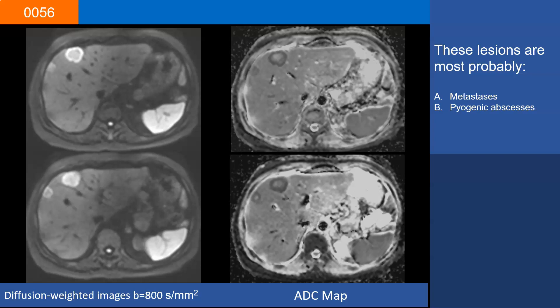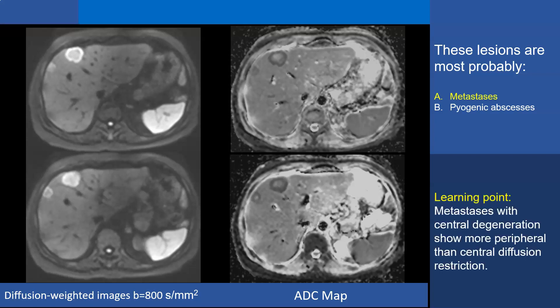Case 56. These lesions are most probably metastases or pyogenic abscesses. On the left-hand side you have diffusion-weighted images with a b-value of 800 s/mm², and on the right-hand side the ADC map. The correct answer is metastases. There is very strong diffusion restriction at the periphery of the lesion, showing as very high signal intensity on DWI and very low ADC on the ADC map, unlike the center of the lesion, which does not show the same degree of diffusion restriction. In an abscess, strong diffusion restriction is expected in the center because pus is very thick and has very high diffusion restriction.